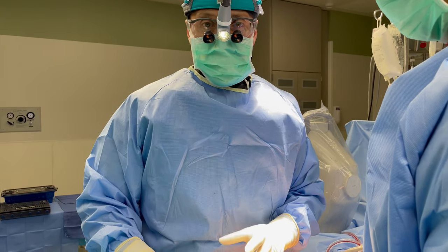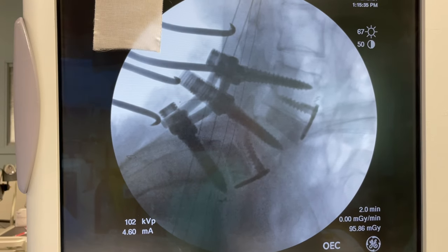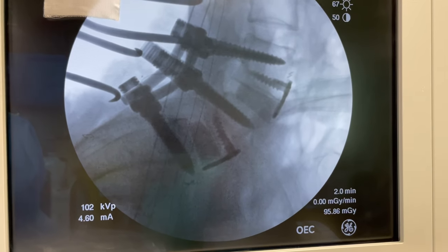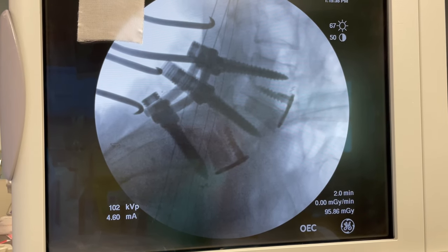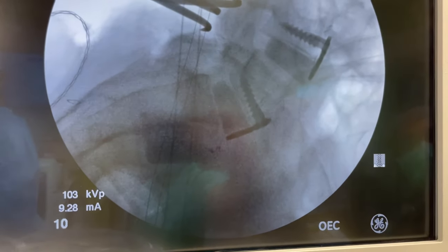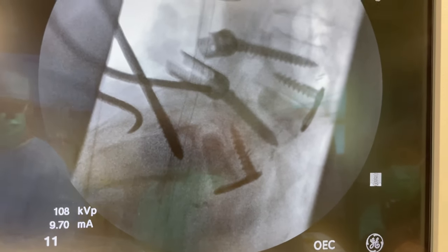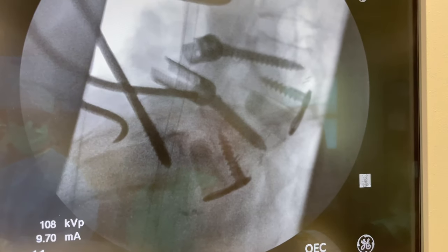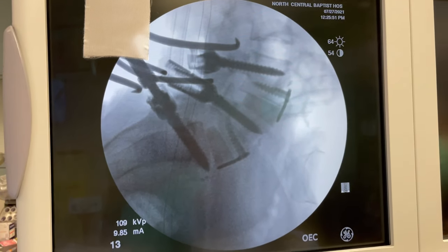That's how you do a spondylolisthesis reduction, and we'll show you some pictures of that. If you look at that picture, we're not completely finished, but it shows you where the screw is in place and the back of the bone at the bottom is now in position. If you go back to the old image, you can see how the bone in the middle is forward compared to the bones behind it — the bones above and below it are further back. Now look at the new image: you can see it's reduced.